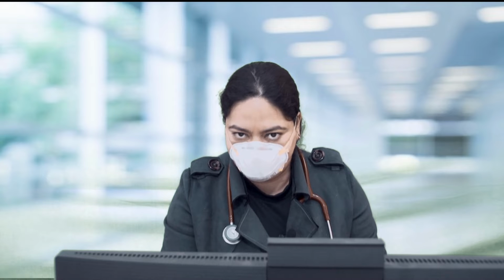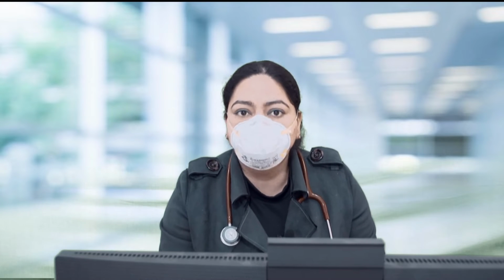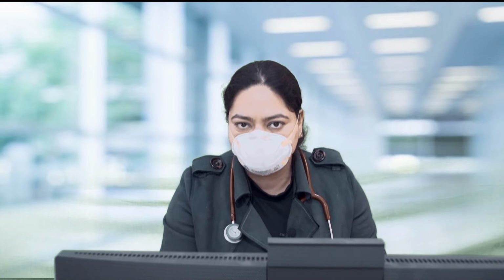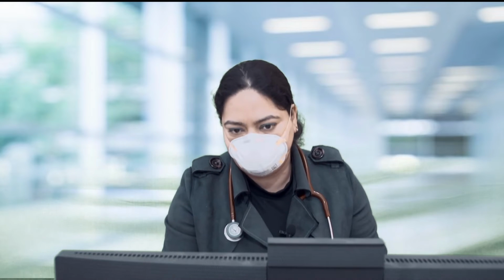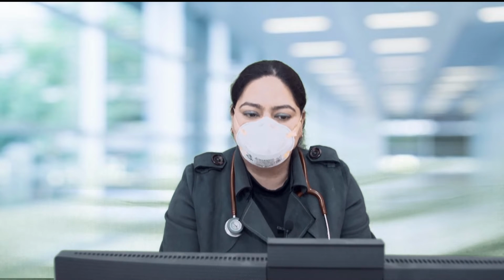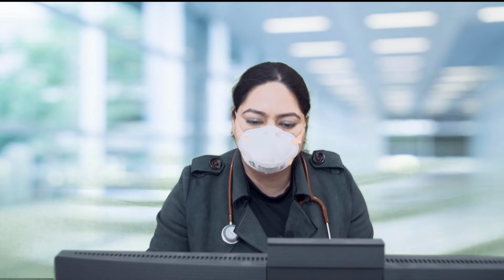BIPAP stands for bi-level positive airway pressure. So why bi-level? Because in this we can set two pressures. One is the IPAP, that is the inspiratory positive airway pressure, and second is the EPAP, that is expiratory positive airway pressure. Hence it is called BIPAP. This is how a typical BIPAP machine looks, and here is the interface, which is a mask by which we hook our patients to the BIPAP machine.